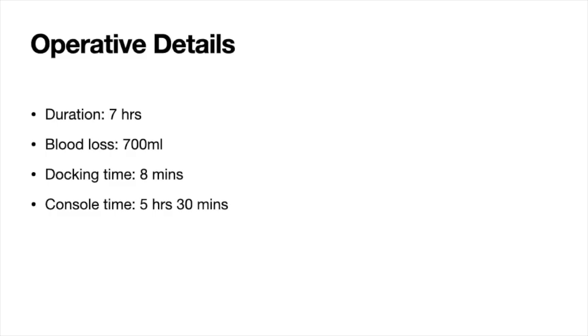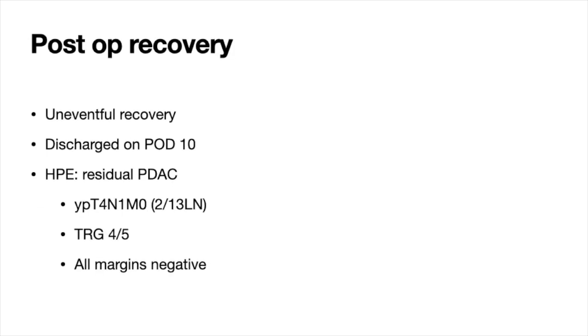The operative time was 7 hours and blood loss was 700 ml. The docking time was 8 minutes and console time was 5 hours and 30 minutes. Our patient had an uneventful recovery in the post-operative period and was discharged on post-operative day 10.